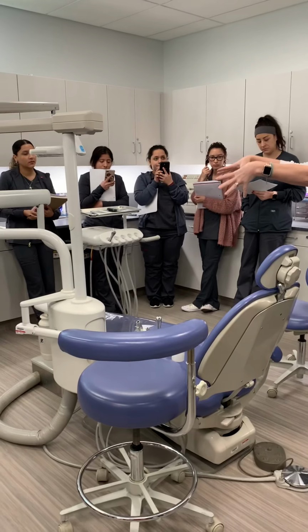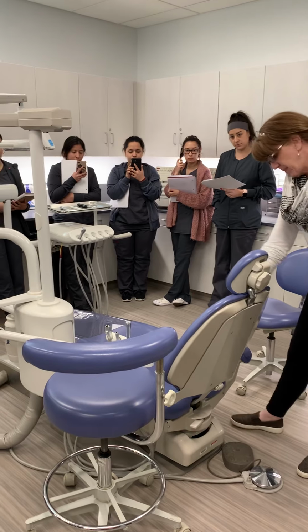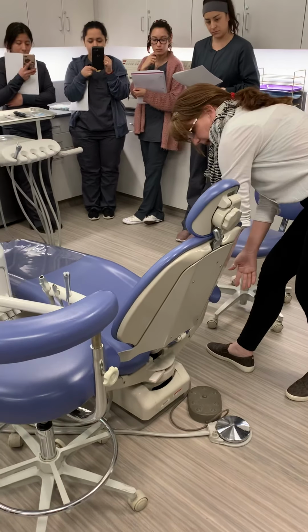And then I'll go to the unit, okay? So we got the headrest, the backrest, the armrest, the body rest. To make the armrest go down, you push the button, and then you pull back up.